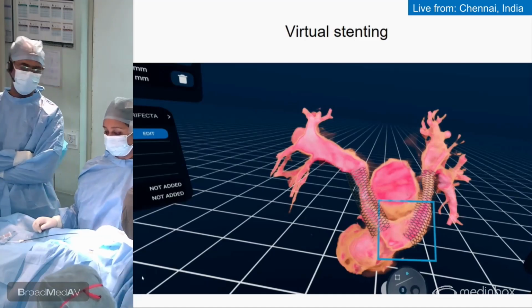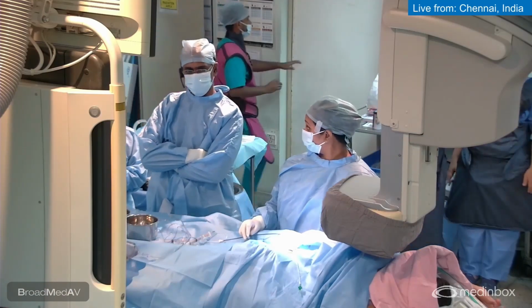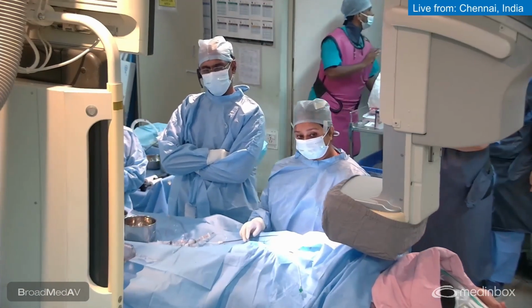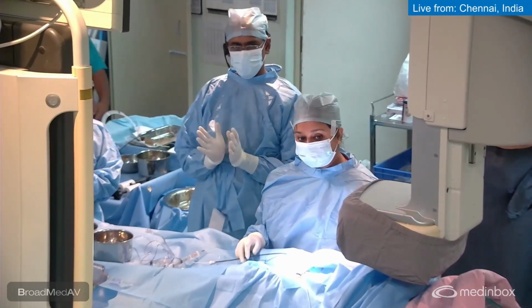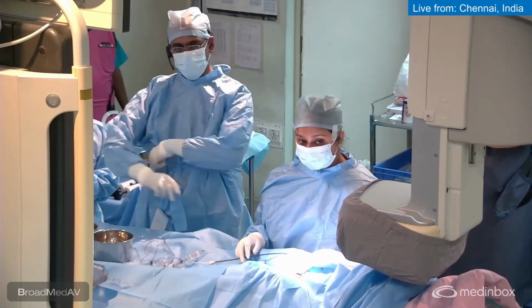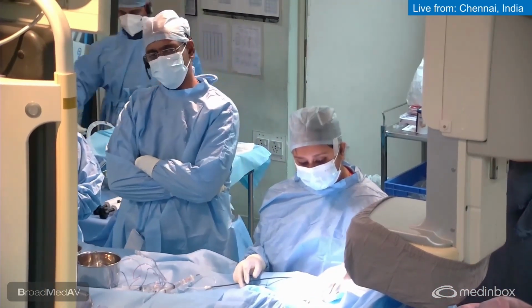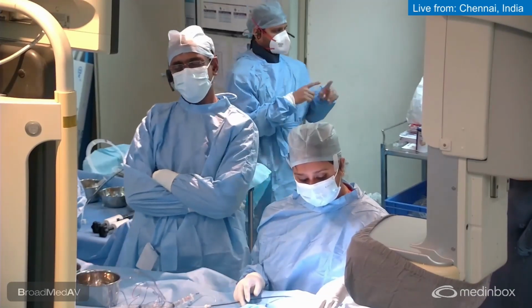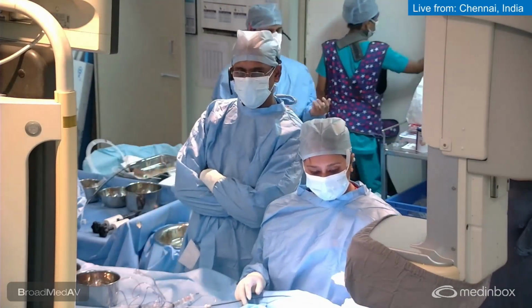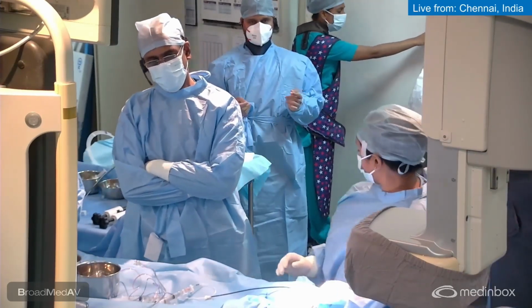That was a wonderful virtual reality image that you have shown, and what we are seeing is the main pulmonary artery located anterior to the aorta, and both the pulmonary arteries are going around the aorta, and so they get stretched, elongated, and in this process they get into bilateral pulmonary artery narrowing. It's quite common problem that is seen in post-arterial switch operations where there are some issues in management.